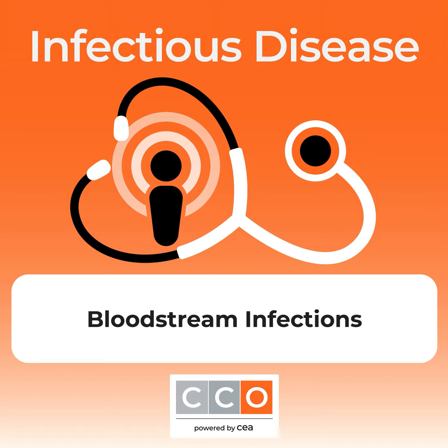And then finally, the Accelerate Pheno is also a little bit unique as it uses automated fluorescence in situ hybridization to identify bacterial and fungal species, but it also does rapid antimicrobial susceptibility testing within 7 hours using morphokinetic image analysis to predict the organism MIC. So this is just an example of all of the amazing rapid technologies out there that we can utilize to help decrease that time compared to our conventional methods.